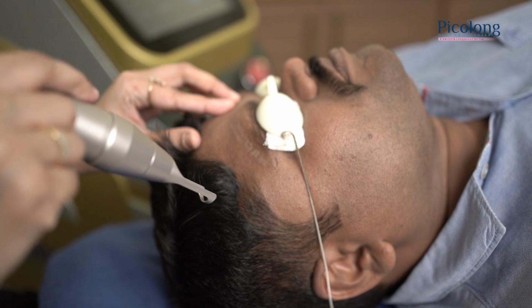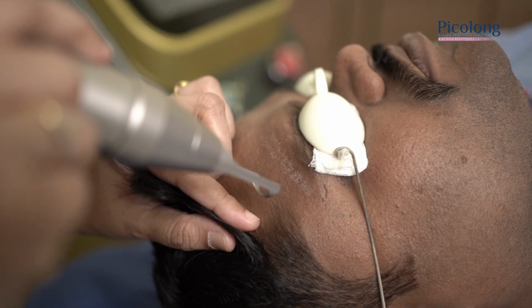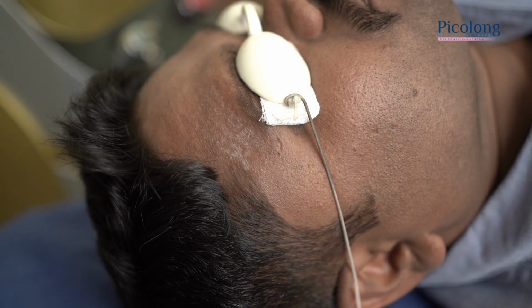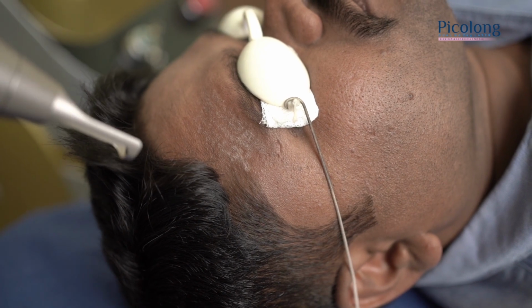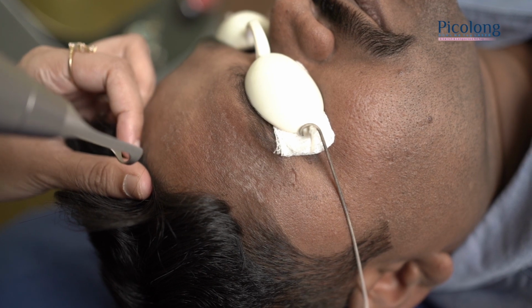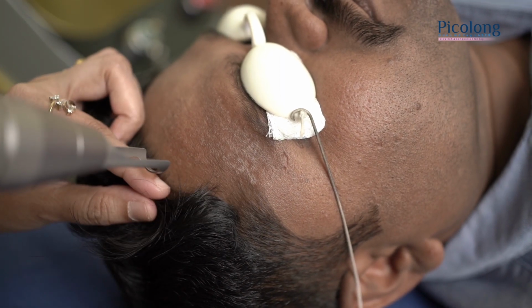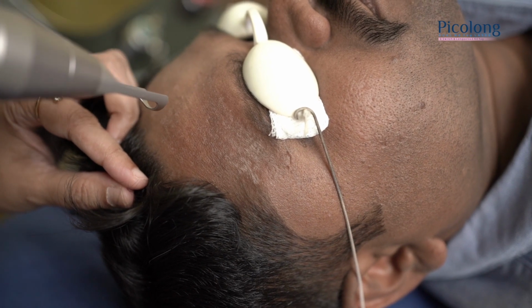As you can see, there is a bit of change in the skin tone, which is the indication that you can't increase beyond this energy. And also depending upon the area, if you still want to increase your spot size, you can do that. Also you can increase the frequency if you're confident enough to move faster. You can see a bit of edema that has come on the skin, which is expected. You should ask your patient to take strict sun protection post procedure.